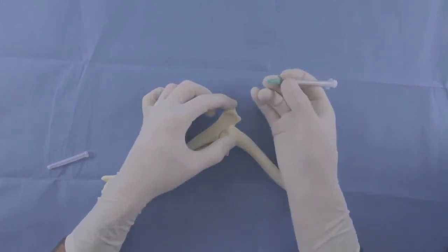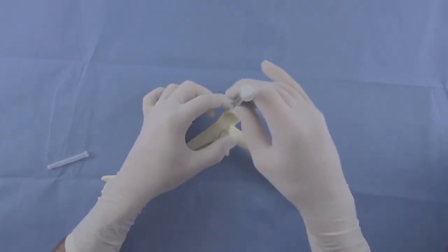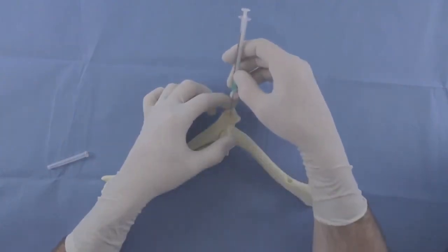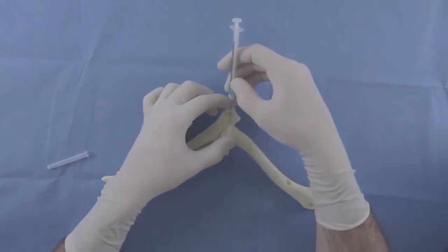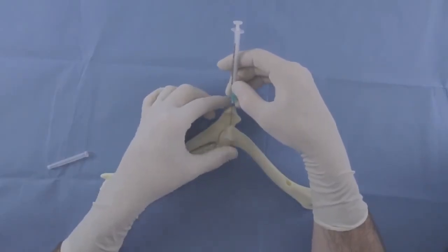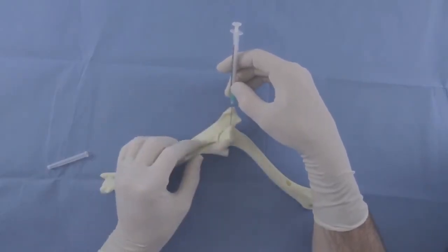Insert the needle perpendicular to your table with the bevel pointed towards the olecranon. This will help prevent the needle catching on bone. The needle is inserted into contact with bone, then it is tilted towards the olecranon. The needle is then advanced under the humerus, aiming back towards the epicondyle.